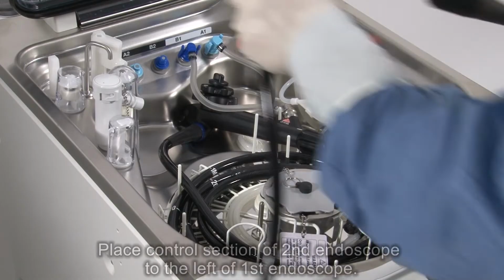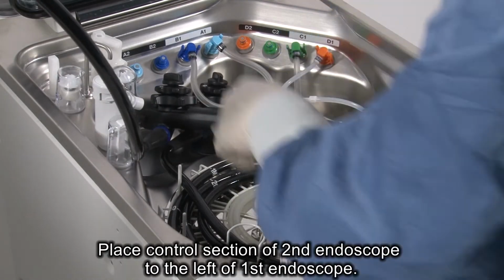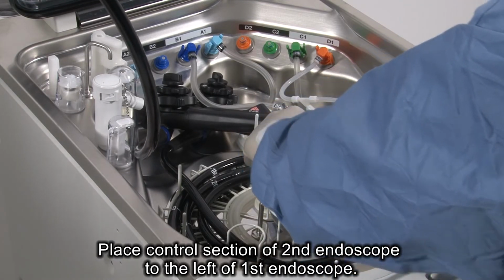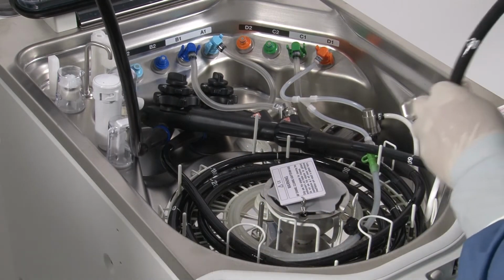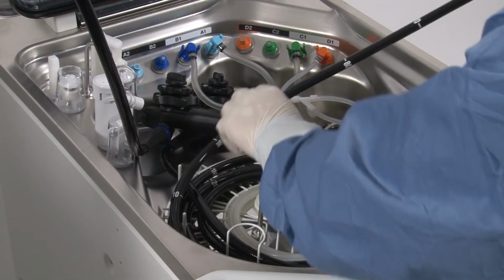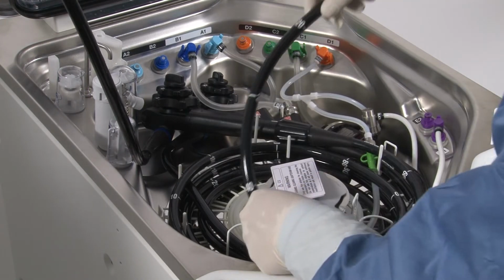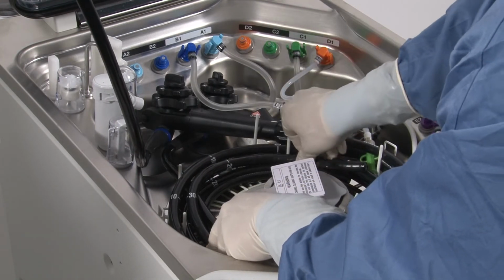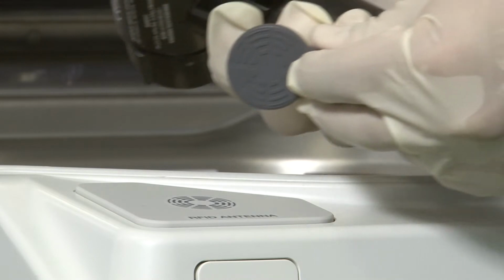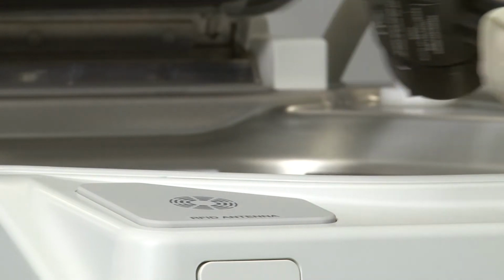If loading the second endoscope, place its control section to the left of the first endoscope's control section. Position the insertion tube and universal cord in the same way as the first scope. Scan the second endoscope's ID tag in the same way as the first scope.